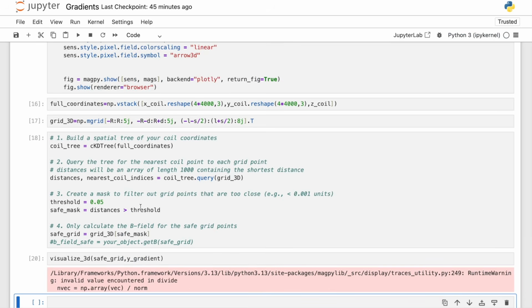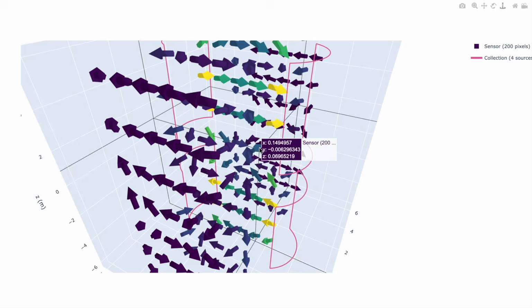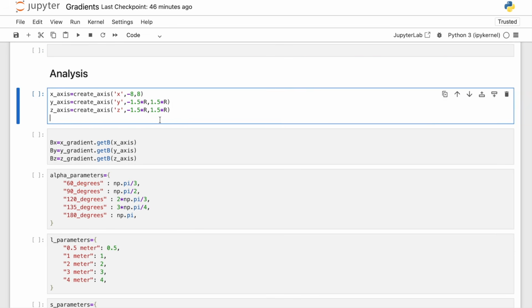So similarly, we expect the same behavior in X gradient. Yeah, so here we got it. So now once we ensure that our simulation and visualizations are correct, we can do some more analysis.